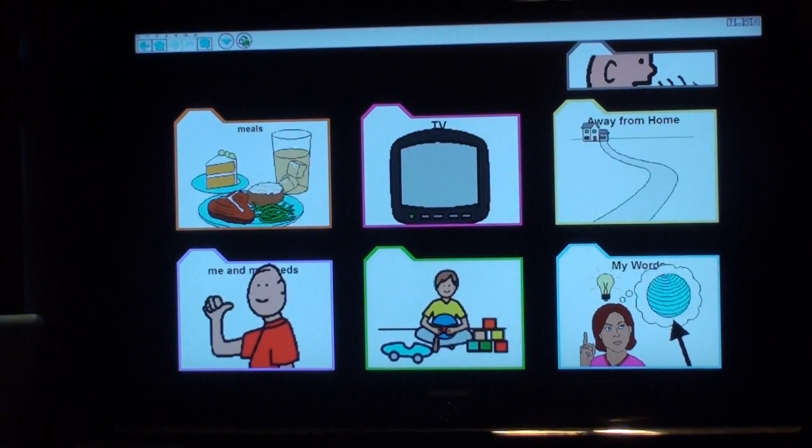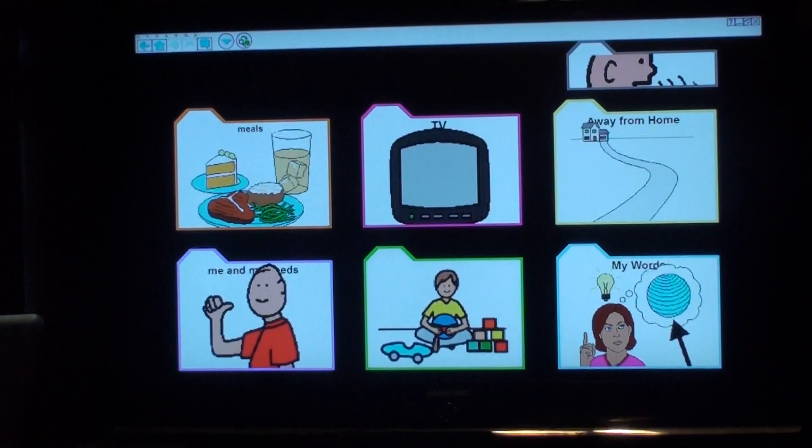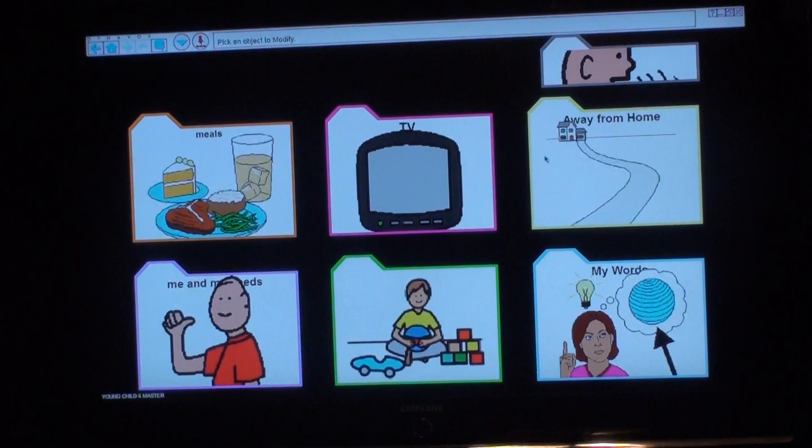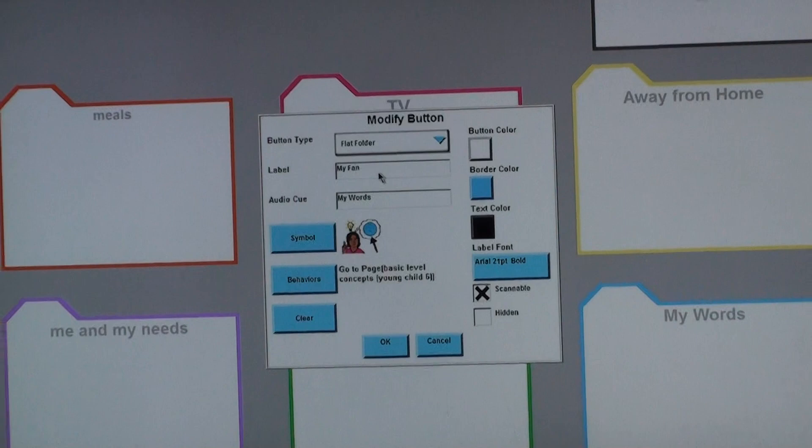Pre-programmed pages make it a lot easier because all the buttons and links are already in place and you just have to modify a few things. When we started, the master page was similar to what we have now but a little different, so we've modified it. There's still one button on this page — the My Words page button — that Rochelle never uses. So I'm going to teach you how to modify a button by changing that one. To do it, you just click on the modify button, go down to My Words, and a menu will pop up. We're going to change the My Words button to My Family, just by changing the name.